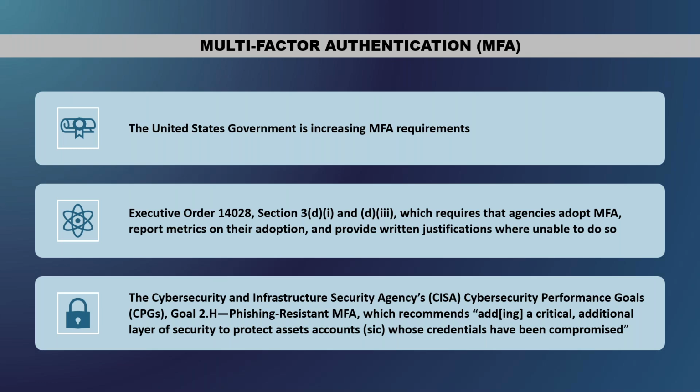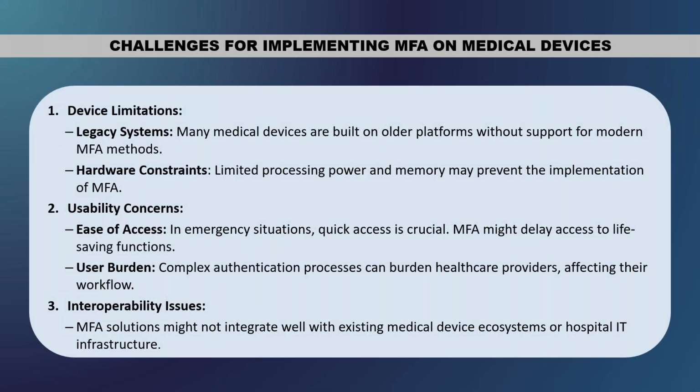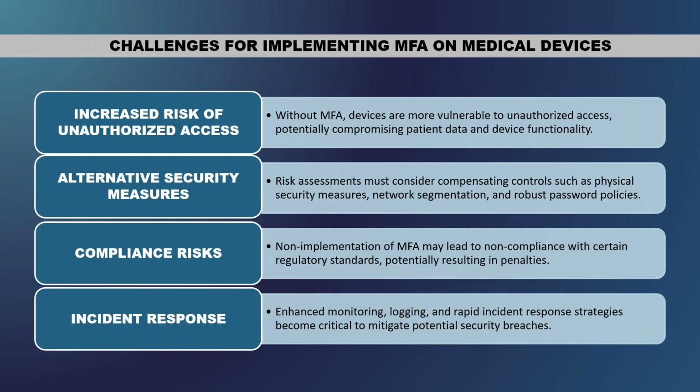Even though we cannot implement MFA, there are always security controls we can put in place to compensate for that. Obviously, the limitations are that, for legacy systems, the device will not be able to do MFA. There may be hardware constraints, ease of access, and interoperability issues.